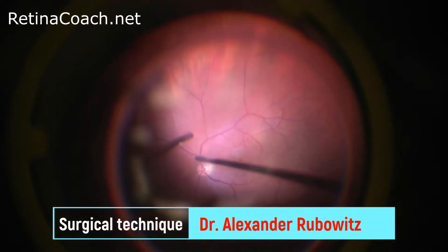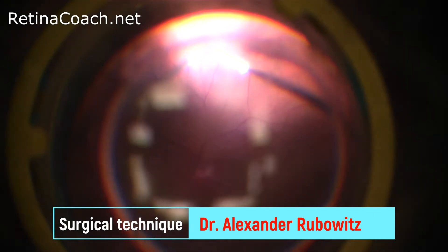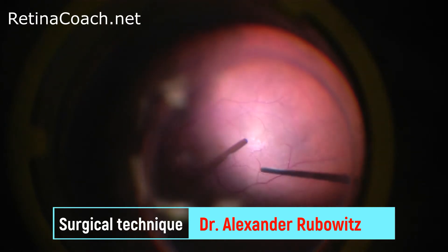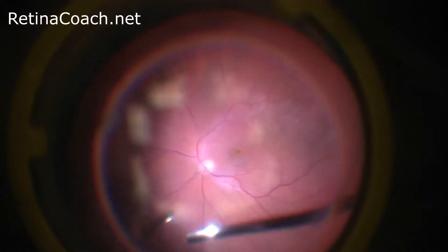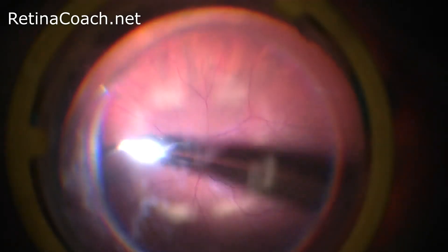Before starting Core Vitrectomy, assure that the infusion is open. During vitrectomy, it is important to illuminate well the area of work and the tip of the vitrector, especially in cases with opaque media. Do not stay in the same place with the vitrector — you need to move and cut vitreous, and not just aspirate BSS solution.